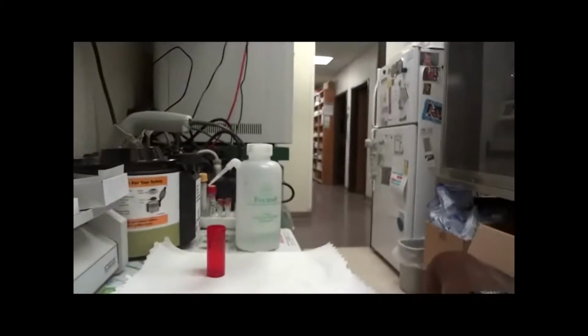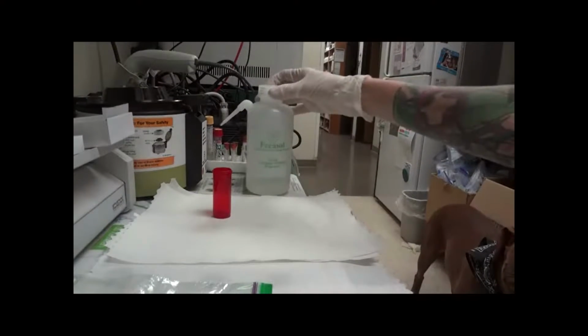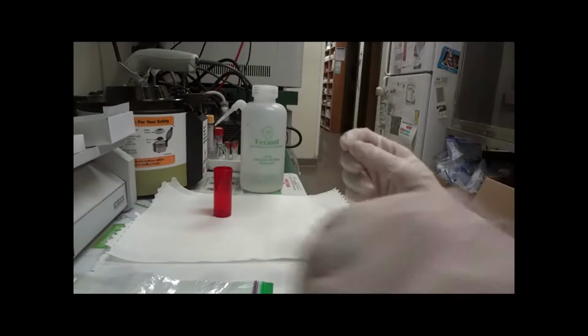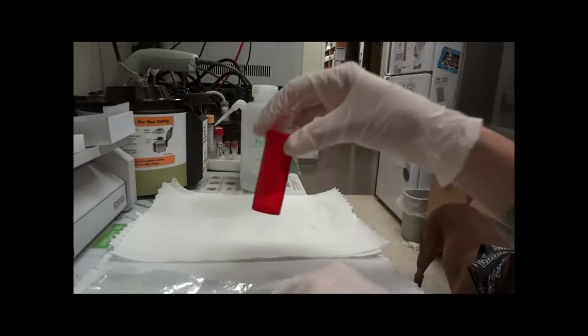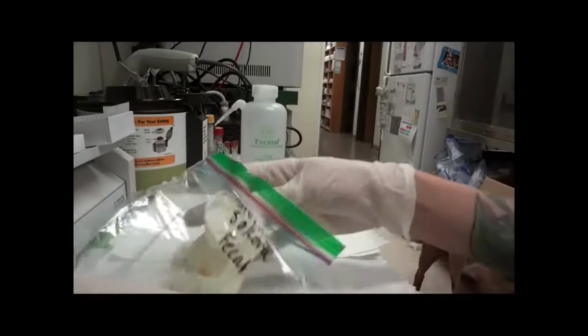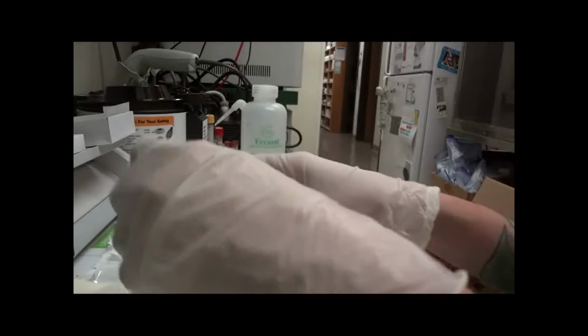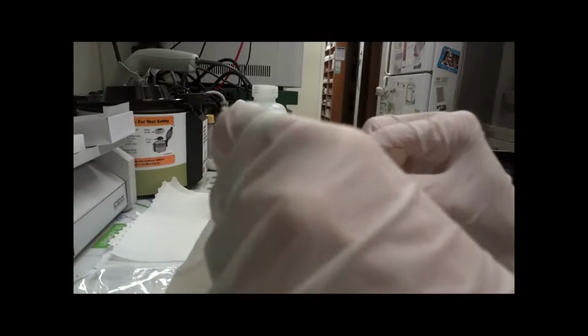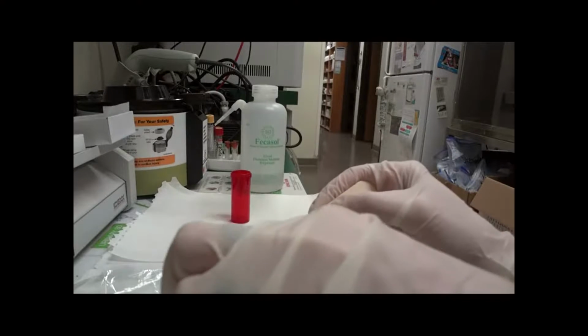Alright, next I'll be demonstrating 4 different ways to run a fecal test. The first being fecal flotation. We do use a commercial fecal solution, so we do not need to mix it in a cup and strain it first. I've got a vial here for us to mix some feces in with the fecusol, or fecal that the owner brought in. We'll take about 2 to 5 grams of fecal matter and place in that vial.